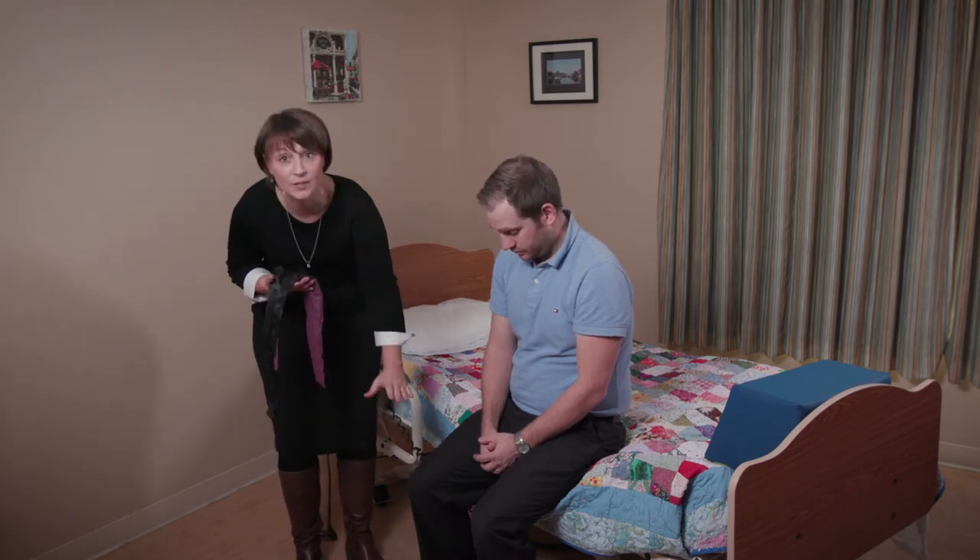In this case we're going to demonstrate how to use this transfer belt. Chris has demonstrated that he has the mobility to sit up by himself and he has that balance. We can see that he's also got his feet flat and his legs are engaged so they can support and weight bear him. But sometimes he's a little bit unsteady, and I know you have clients like this that often perhaps they can walk and they can move but they need that little bit of support.